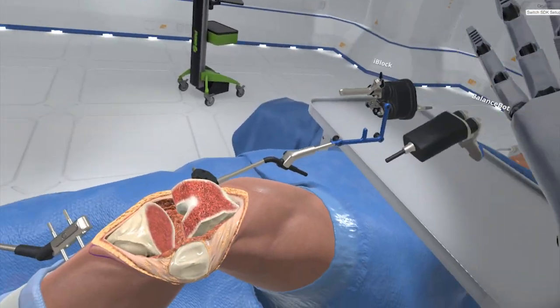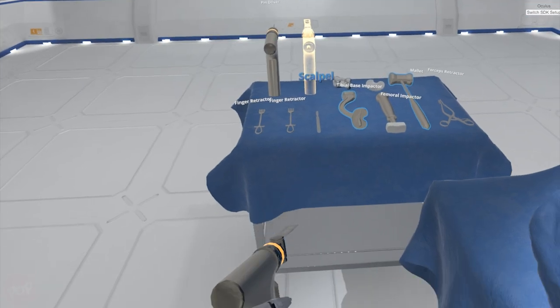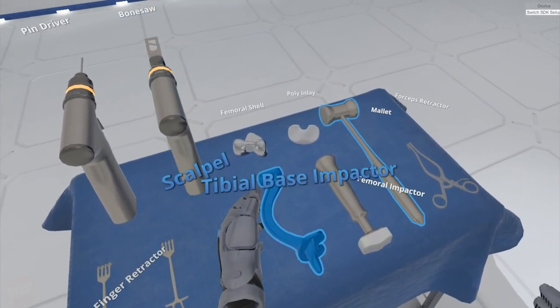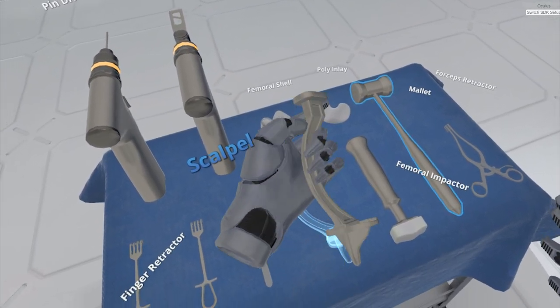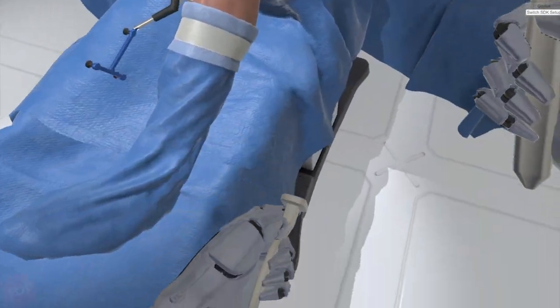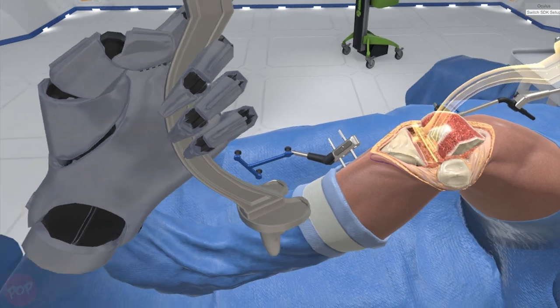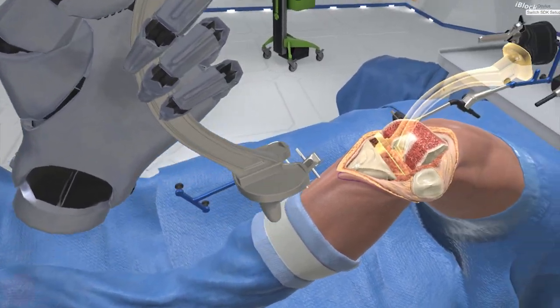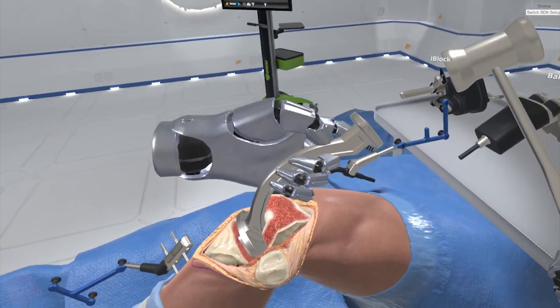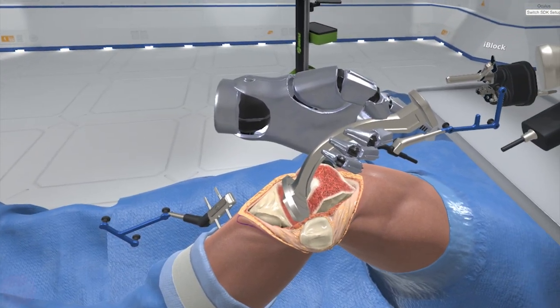Grab the tibial impactor and mallet from the Mayo stand. Hold the tibial impactor in place. Now strike the impactor strike pad with the mallet to impact the tibial tray into the tibial plateau.